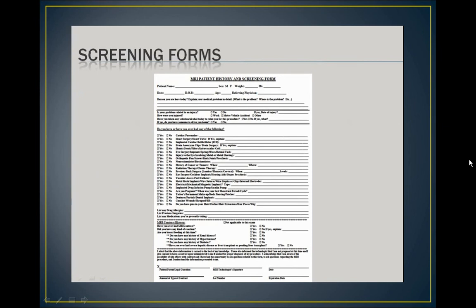If a patient answers yes to any one of these questions, the MRI technologist needs to be clear if the device or implant is safe for the MRI exam, and if unsure, we may need to acquire an implant card or operative note for that device. In cases of any allergies or renal or liver disease, if a patient needs a contrast injection, it must be determined by the radiologist if any pre-medication is needed prior to the injection. You will discuss IV contrast issues further in the class during your MRI contrast and NSF module.